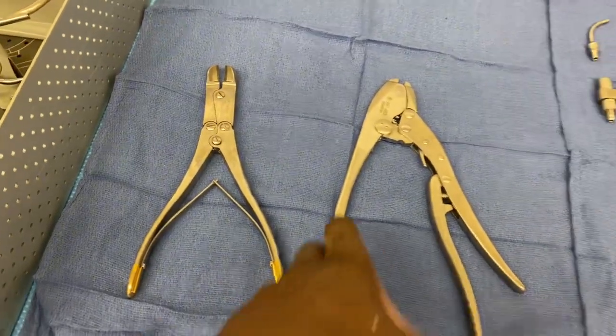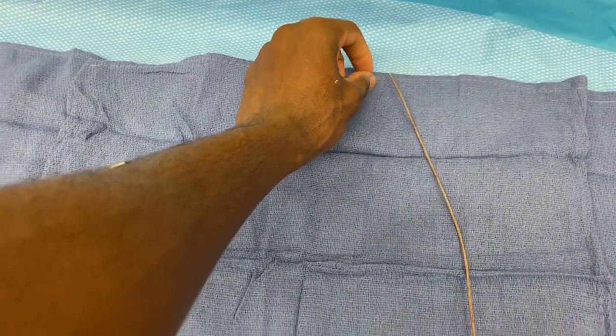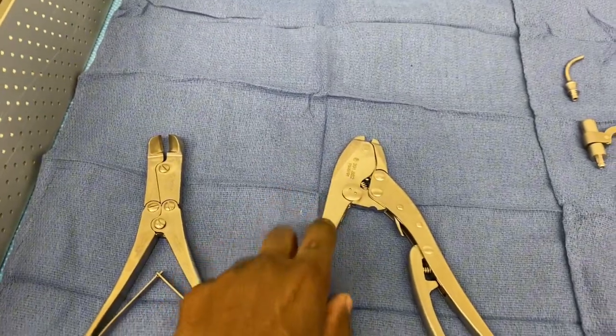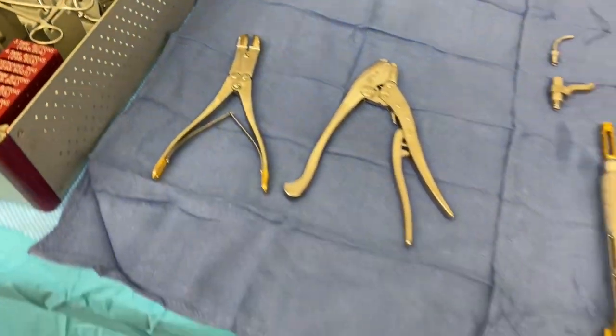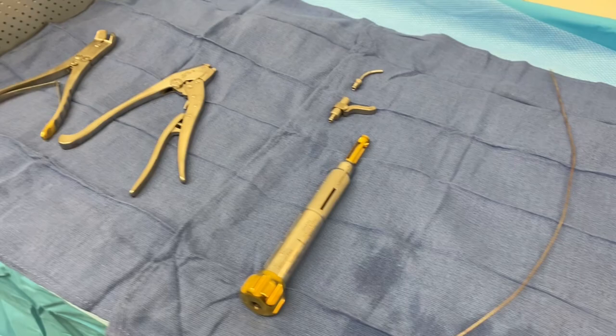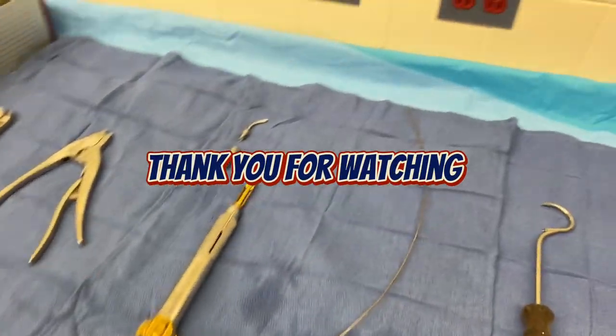Then they'll use the crimper. There's a little piece at the top of your cable — ours is already off of it — they'll tighten it up with the crimper, then they'll use the cutter and cut it. And that's it — that protects the femur after there is a little fracture. That's it, thank y'all, peace, have a good day!